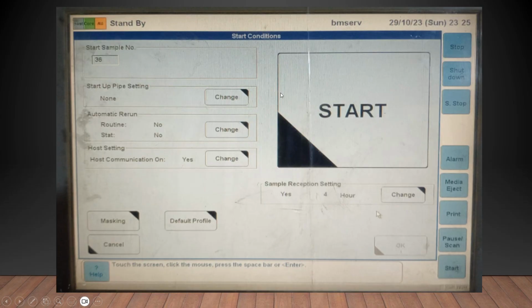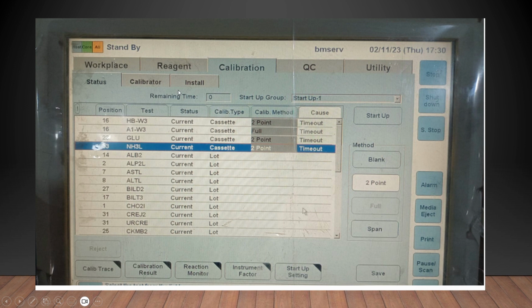If there is any problem in the calibration, then the alarm will tell. This will be a yellow alarm only, so it will tell that calibration has failed. So you can just go to the status and check. In this position, the glucose, even the timer, everything will be gone, so it will be like how it is here. That means the calibration has passed.